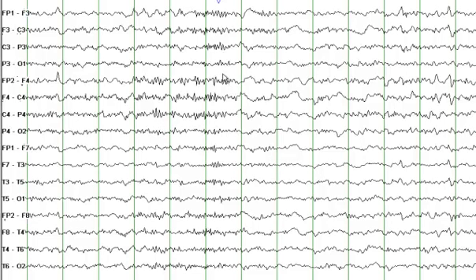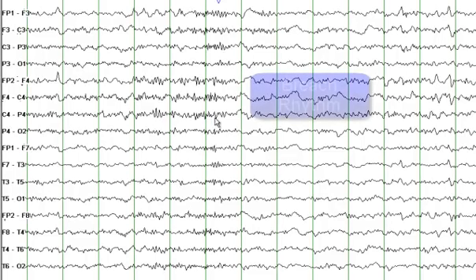You may want to question the technologist if this patient had any skull defect given the clinical history. Patients with skull defect may demonstrate higher frequencies and amplitude in that region, which is also termed as breach rhythm.